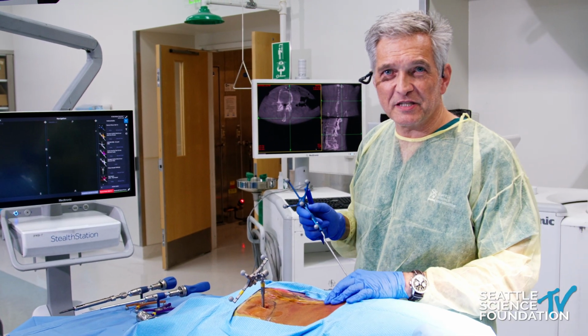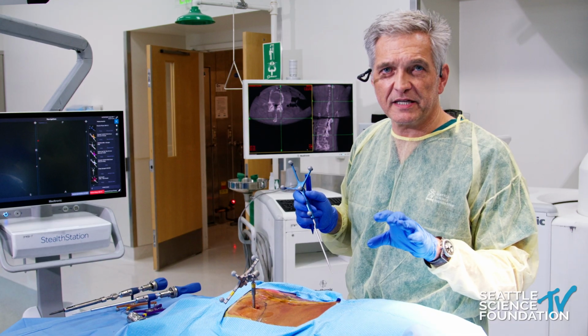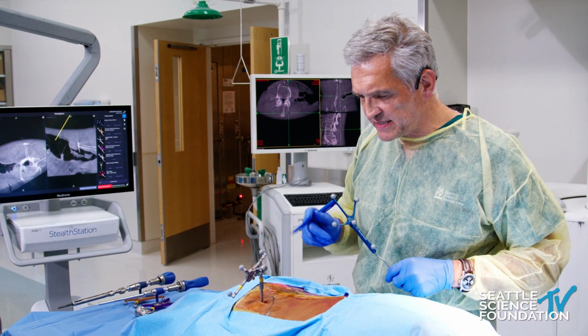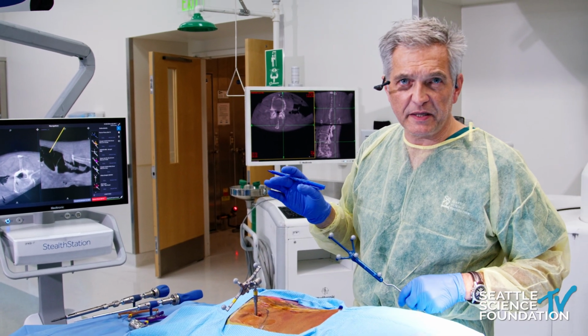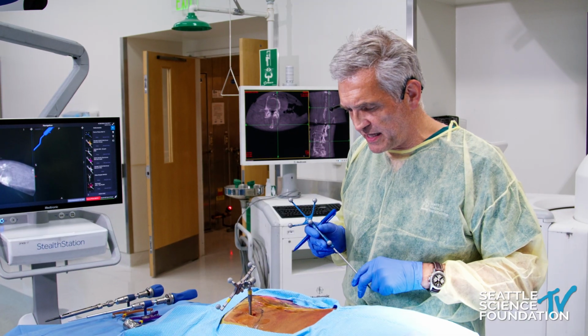So for the pedicle screws, the pedicle screws obviously require the greatest accuracy. So I start with that first. I make 2 incisions for the MIS TLIF. We're only going to go through the screw placement here, and maybe I'll show you how I place the tubular retractor, or the trajectory at least, a little bit later.